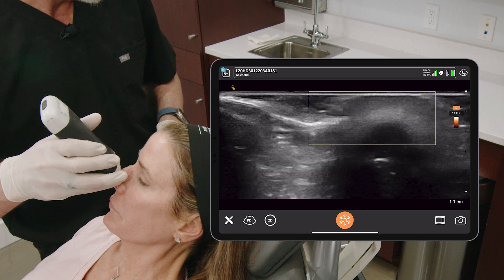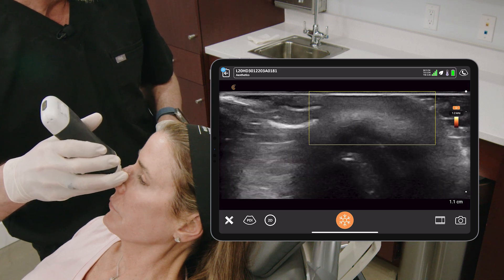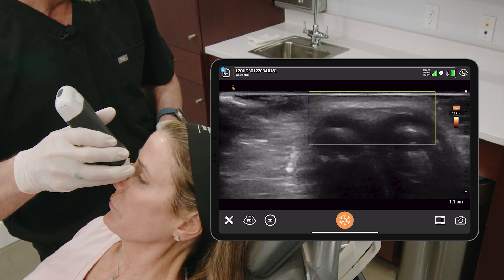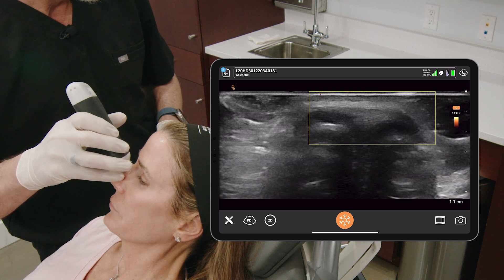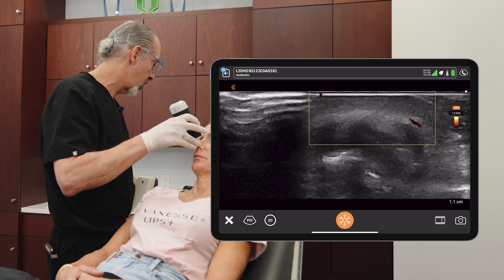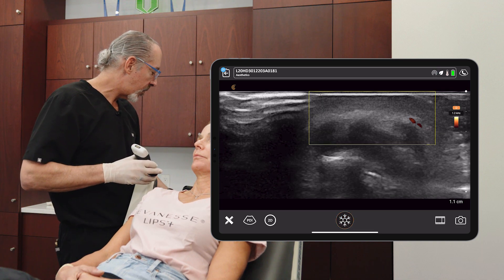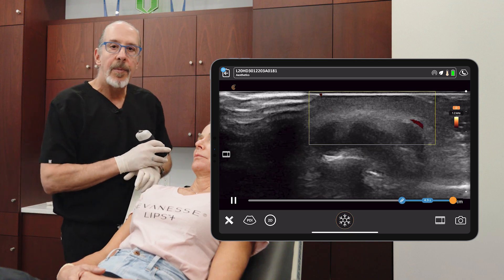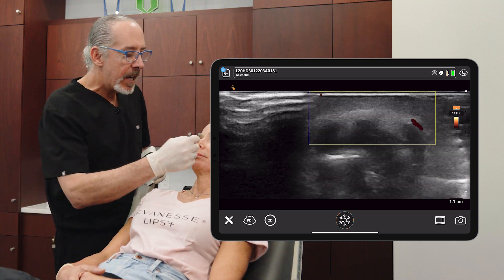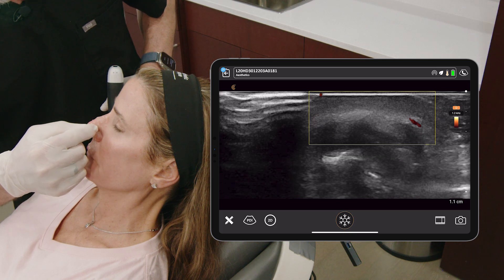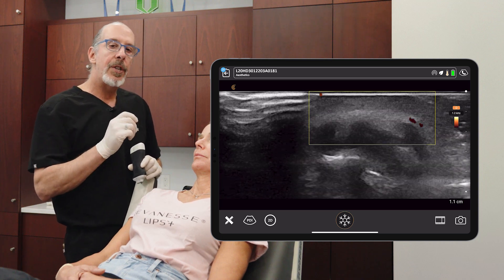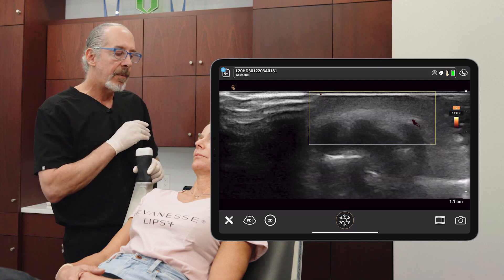Let's move down a little bit and look in the super tip area. What I'm seeing here is probably a branch of the lateral nasal artery. The lateral nasal artery is a branch of the angular artery, and it comes just superior to the nasal alar groove and comes up here. You see that that's also a deep artery, but it's not recommended to inject too far off the midline for vascular risk.